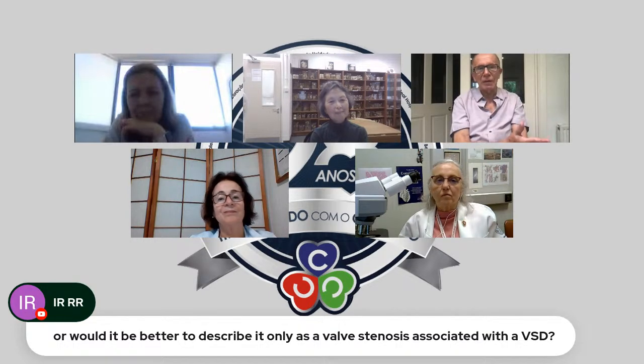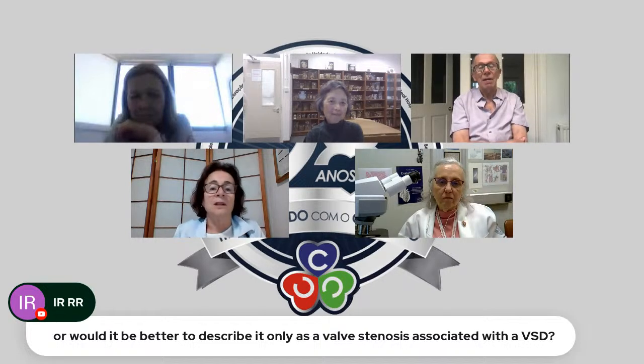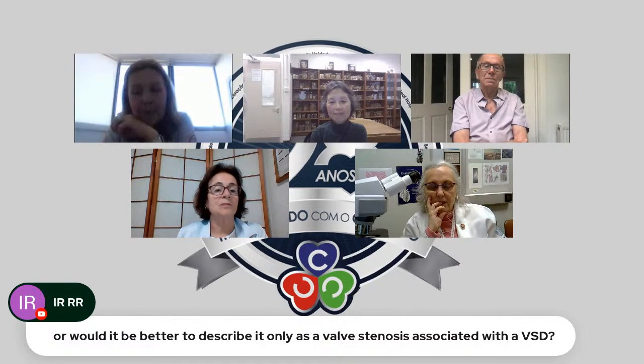Well, it's interesting that in my team, somebody diagnosed it as being a case of tetralogy. But I kind of agree. I think what is important, again, as you all have taught me, Jan and Vera and you, Mike, is to describe in detail what you are seeing. You may use the term or not use the term, but it's very important to have the description of every detail about the VSD, the presence or not of the infundibulum.